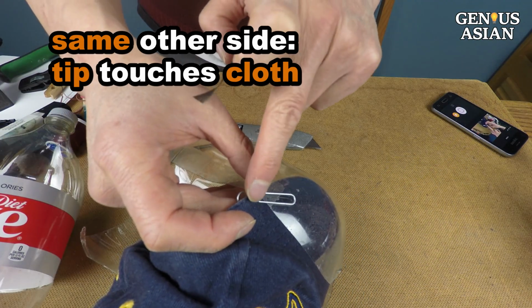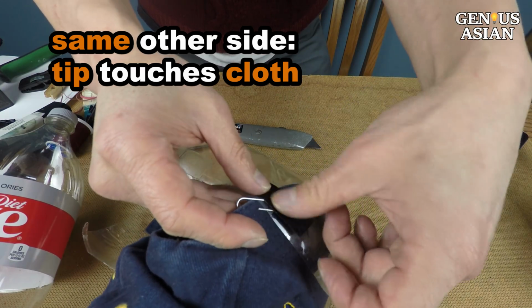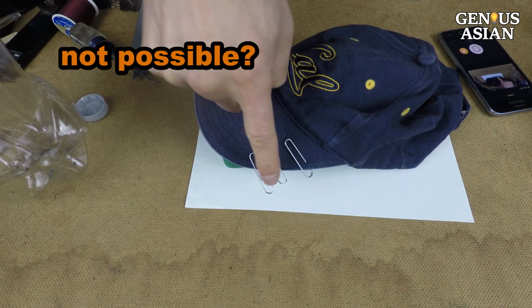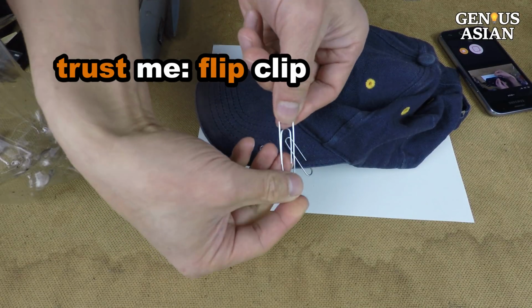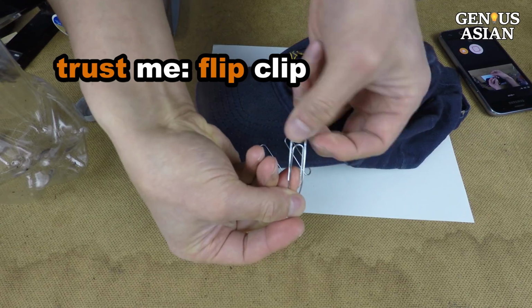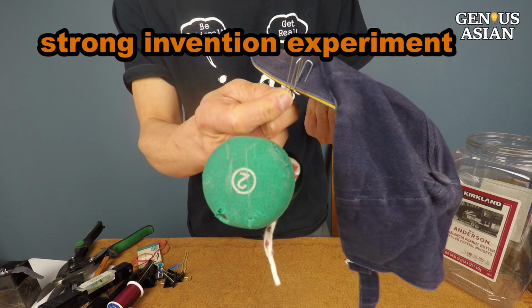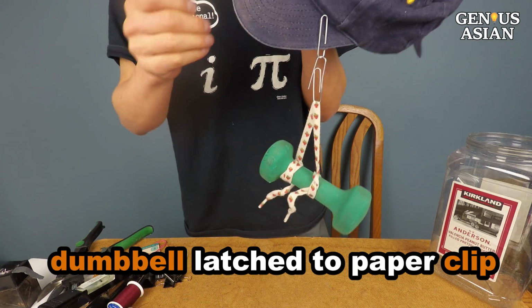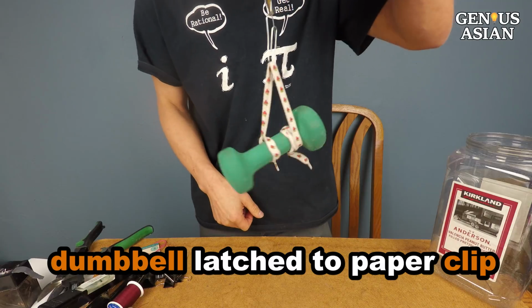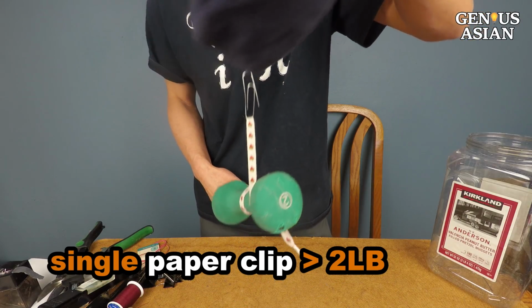For the other side, you need to do exactly the same thing. The metal tip needs to be touching the cloth. If your mind tells you it is not possible, then you have to have some faith in me. Flip the paper clip. I guarantee it'll work. I will demonstrate how strong my invention is by showing you an experiment. This is a 2-pound dumbbell. I latch the dumbbell to the paper clip. See? This single paper clip can hold at least a 2-pound weight.